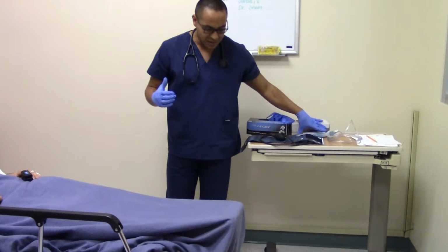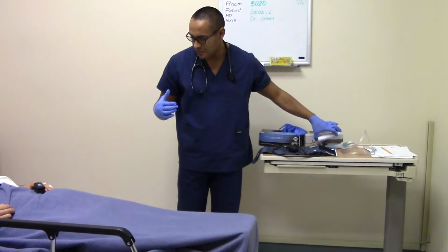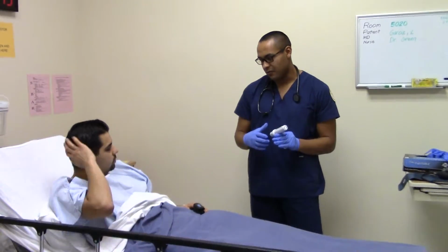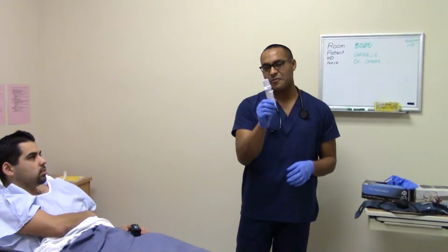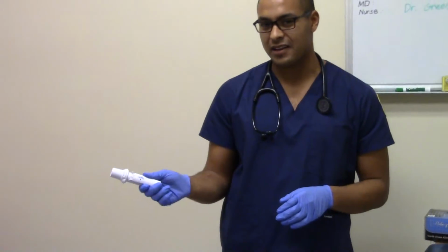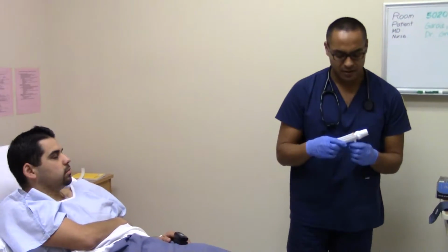Okay. Do you feel you could use the peak flow? What's a peak flow? Pretty much it just reads how strong your lungs are right now, before and after. Okay. Usually, I would not. He kind of scared me a little bit. He said he couldn't breathe that good. I don't know if I would even continue doing this because I would treat it. But for competency's sake, I'm going to say he's going to survive and do well.